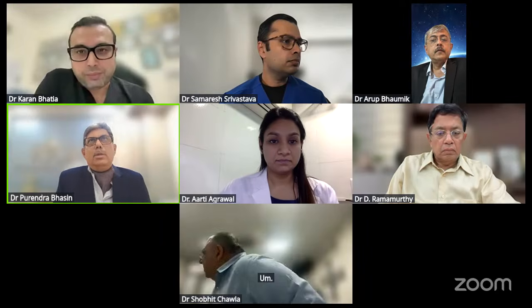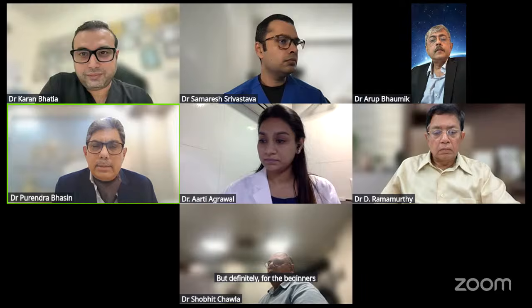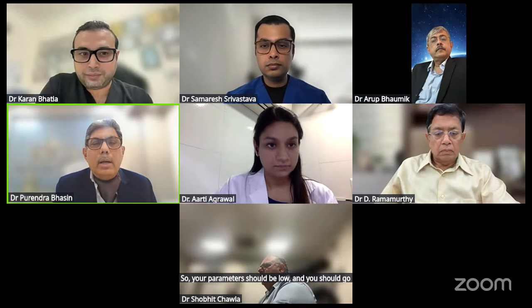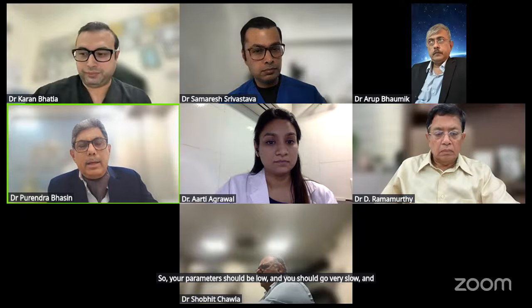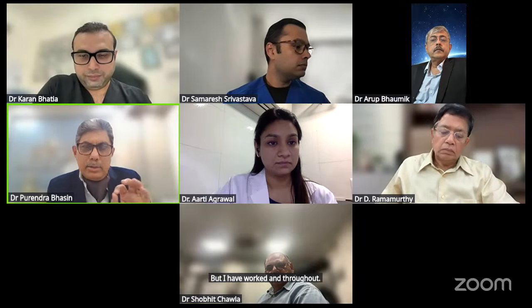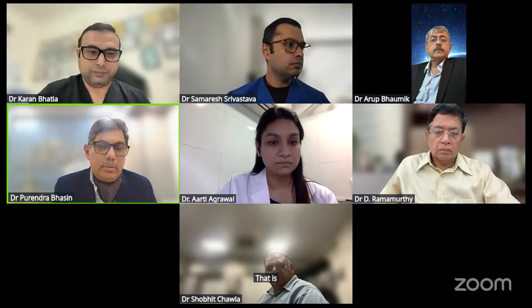Karan, with experience, you can manage the parameters with your foot pedal. But definitely for beginners, I will say that your aspiration should be low and you should go very slow. So your parameters should be low and you should go very slow. In all these cases, the chamber should be filled throughout with viscoelastic. That is a must.